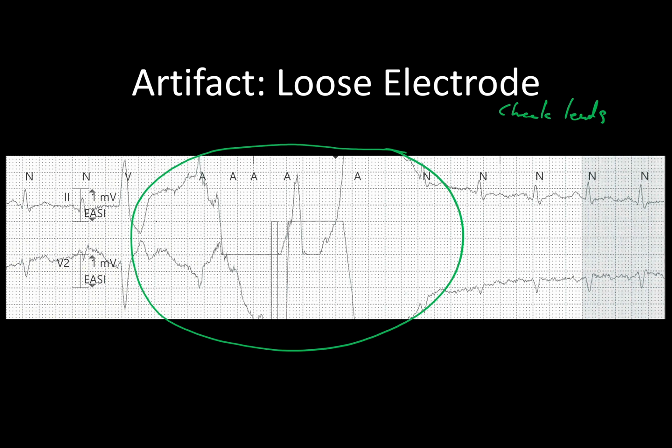What you're going to be looking at is the chest hair, because it may not have been clipped, and so you need to remove that chest hair and replace the lead. Replace any leads, if not all of them, to see if that corrects this issue. Check the inside of their gown. Sometimes the lead catches on the gown and the patient's body, so when they move around, it gets really bad, but then you walk in there, they sit still, and it looks fine.